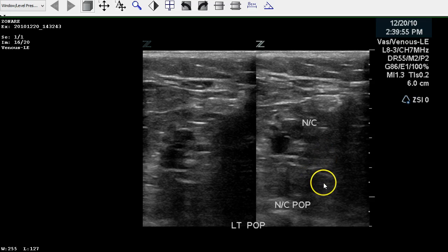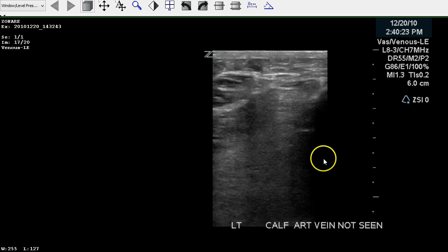Here on the left side, we also see a non-compressible popliteal. We'll do the same measures to check whether this vein is totally or only partially occluded. The calf artery and veins are not seen, which is also important — as a sonographer, we don't make things up. If we can't see it, we can't see it, so we just state that on the image and in the report.